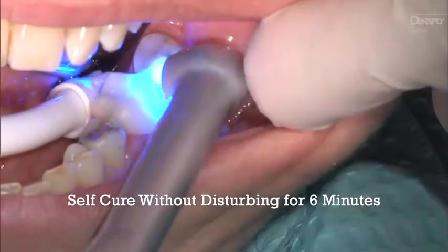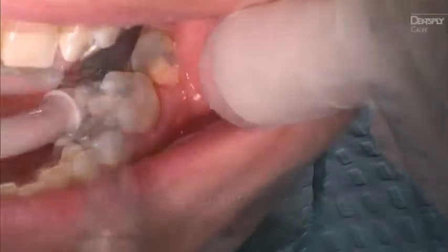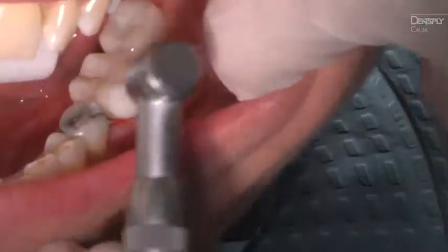Allow Calibra Universal to self-cure without disturbing for 6 minutes from start of mix. Finally, finish and polish the restoration.